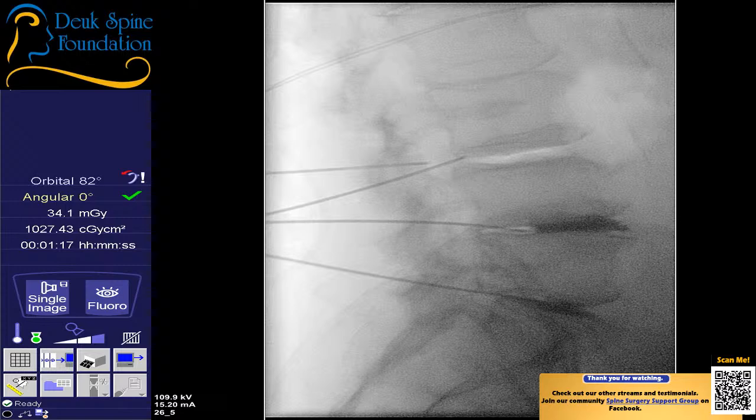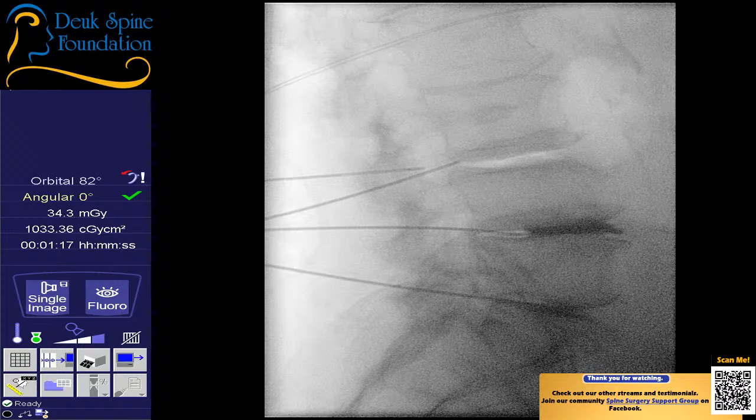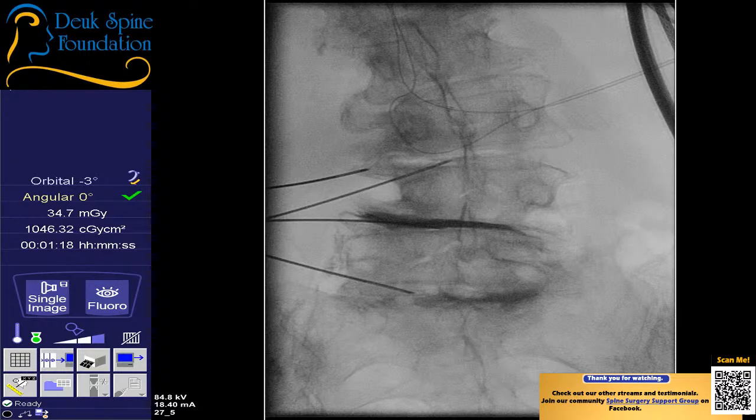Where do you feel it? What'd she say? In her leg. In her leg. Is it gone? It's gone. Give me an AP. That's interesting. Blood pressure good? Yeah, I see. It's more lateral.